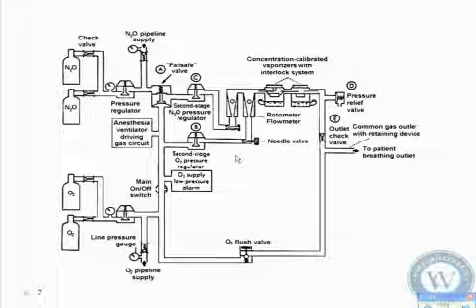Right? Now, if the PSI of oxygen falls down, so if we go from 50 now down below 30, 30 is the cutoff point for this, and this thing cannot open if the PSI pushing up on it is less than 30. Therefore, it will shut all nitrous off. You cannot get nitrous at that point, period. If your wall pressure falls or if your cylinder runs out, it's going to cut nitrous off. If your internal pressure of oxygen falls less than 30. All right? So you understand how that works?